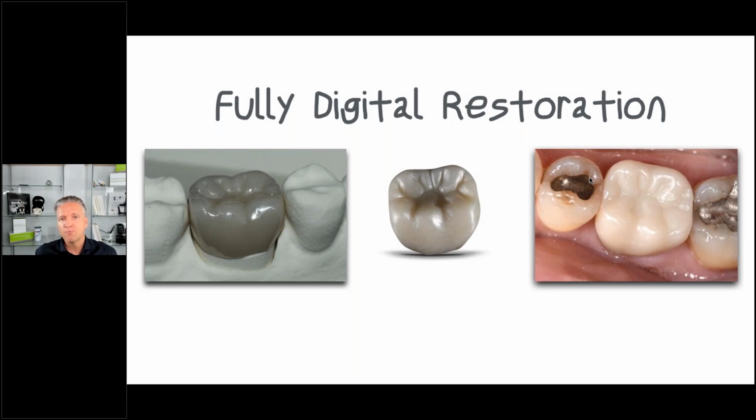I was always bothered by that scenario we have now, running down the digital dentistry road, and we love what we do and we are happy. But now we can print the models, we can mill a crown, we can glaze it and just ship it out, even model free. It's all nice, right? But for me and my team, when we send cases out, it has to be a tooth, not a crown. And I'm just not satisfied with what I'm seeing there.